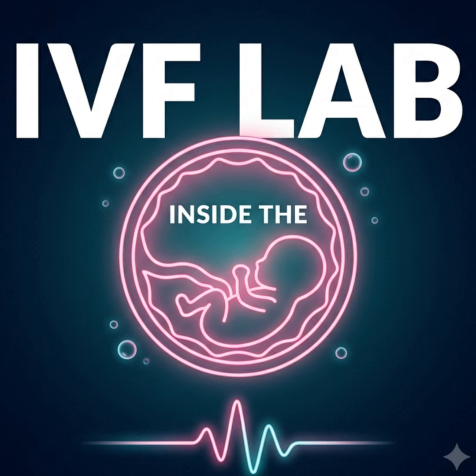Exactly. Biology is exquisitely sensitive to its environment. An AI trained on specific lab conditions might completely fail or generate skewed rankings when applied to a different setup across the world. This is why the scientific community constantly warns about the risk of over-relying on software-derived scores. You can't just blindly trust the machine. You really can't. An embryologist cannot simply relinquish their expertise and blindly follow the computer's ranking. They have to deeply understand the limitations, the training data, and the biases of the tool they're using. AI in the IVF lab is a decision support tool. It is not an omniscient oracle. It is a tool, not an oracle.